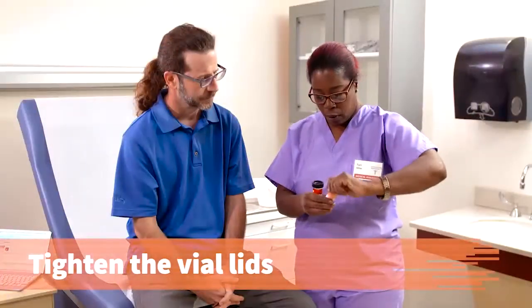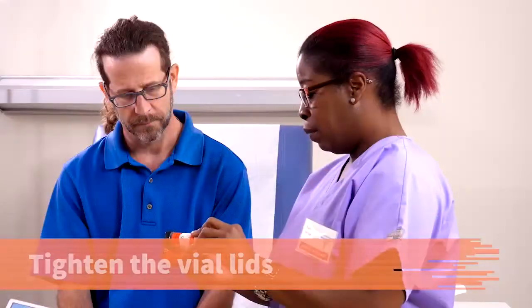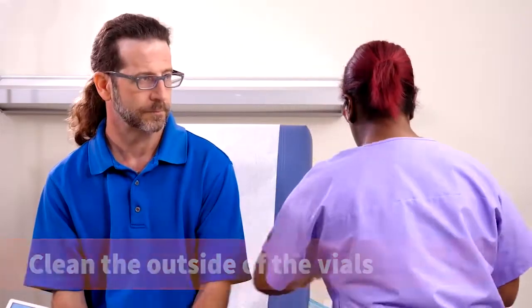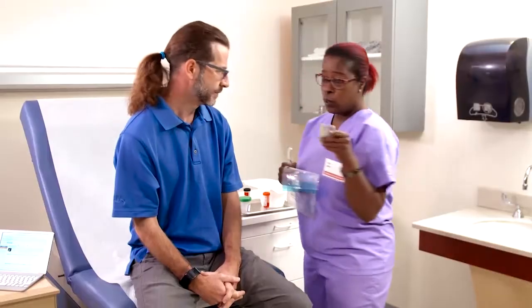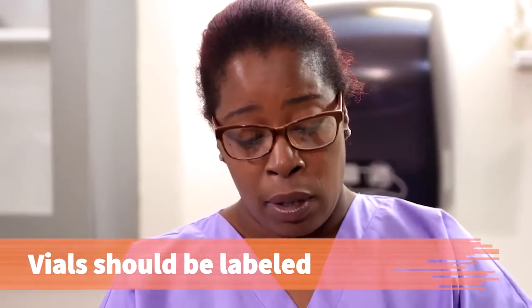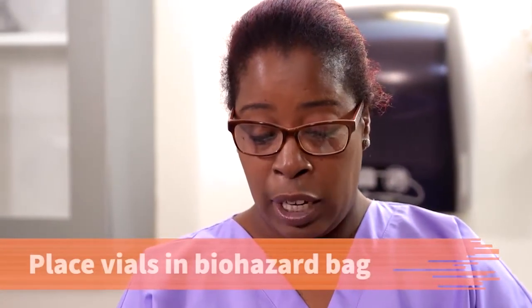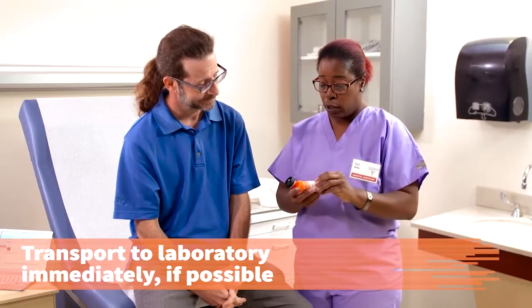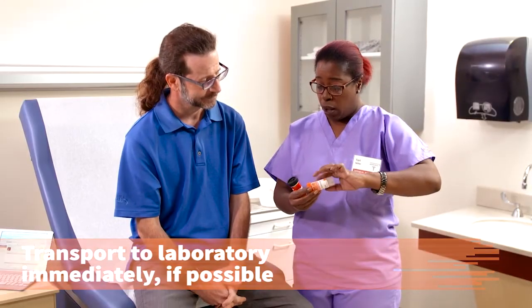Instruct the patient to tighten the caps completely and wipe the outside of the vials with alcohol wipes or to wash carefully with soap and water. I will also put a few alcohol wipes in there for you to wipe the outside of the containers. The vials should be labeled, placed in a biohazard bag with a zippered closure, and transported to the laboratory immediately if possible. When you are done collecting the samples, you need to make sure that you are putting your name, date of birth, all your information, and also the date and the time that the sample occurred. Okay. You're going to put that on each one of the samples.